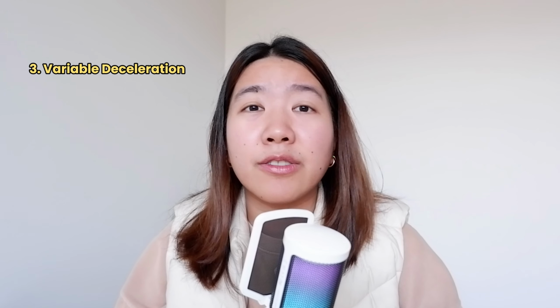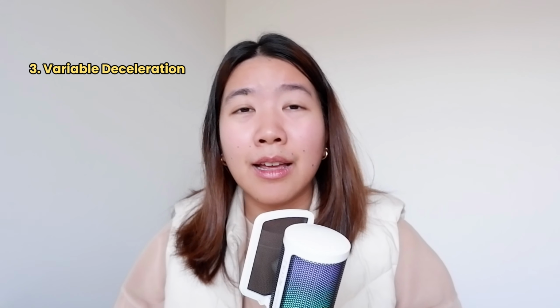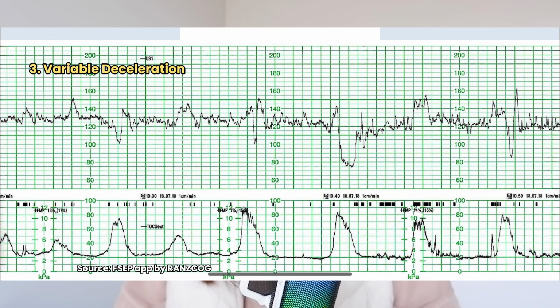Number 3, variable decelerations. Variable decelerations vary in timing and duration. They don't follow any pattern of the contractions. It is a normal physiological response to a slight fall in oxygen and is associated with cord compression. If it is just the variable deceleration by itself, it is okay to happen, especially in labor because of cord compression, but if it has some complicating features as well, then we are going to be concerned.